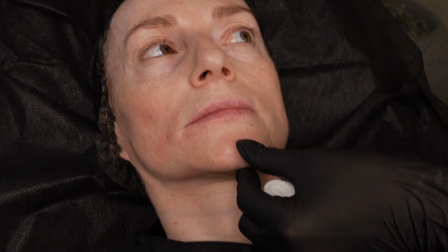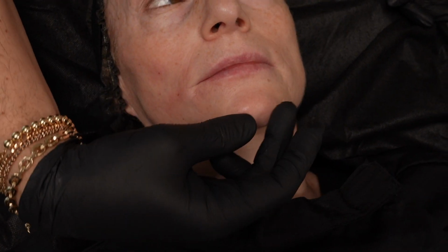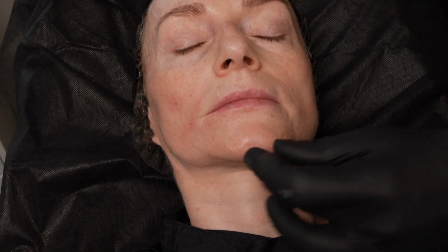Не надо открывать новый, вот этот возьмите иглой в центре. Или канюлей, если хотите. You can do with cannula. Я иглой использую, делаю. Доктор говорит, иглу возьмите. Попробуйте, если вы иглой не пробовали. Нет, я иглой наоборот делаю. Тогда канюлю попробуйте.